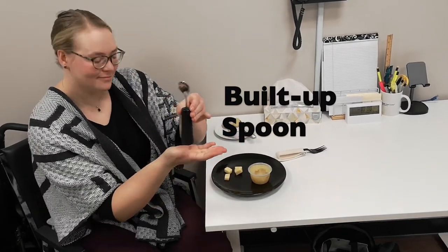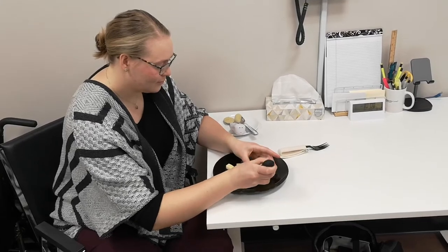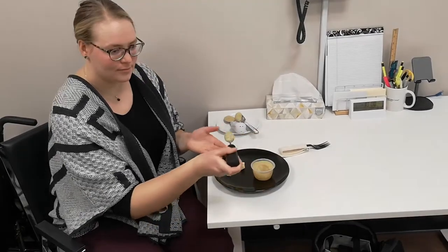The next option would be a built-up utensil, which can be helpful for individuals with reduced grip strength. A bigger handle is easier to hold on to.